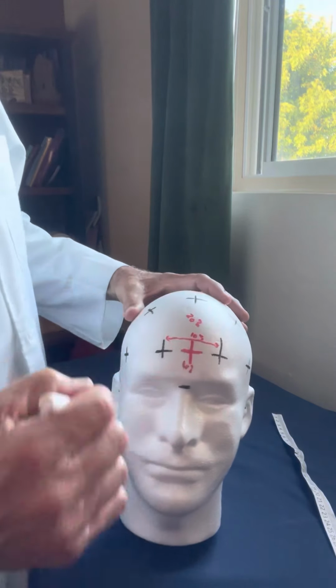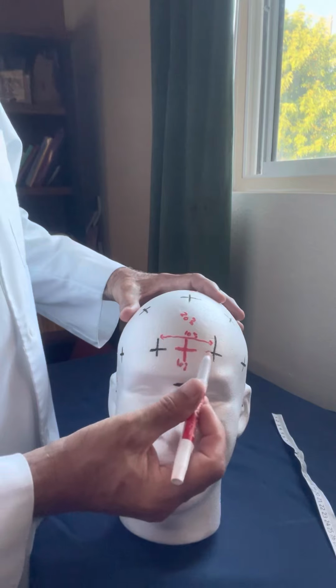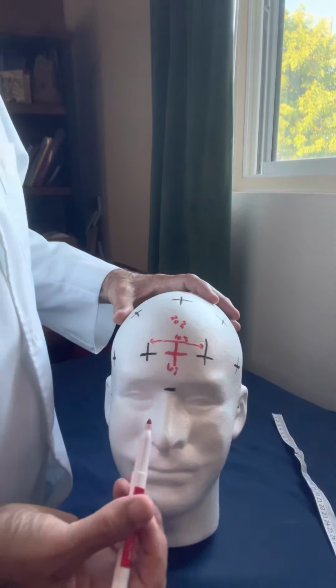If you remember, when we did FP1 on this side and FP1 on this side, it was 10% of half the distance of the head.